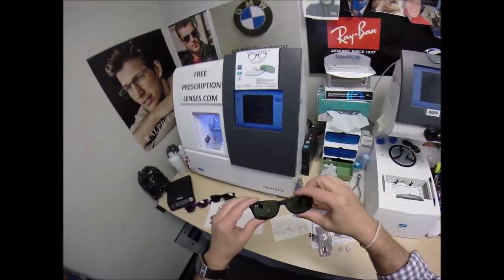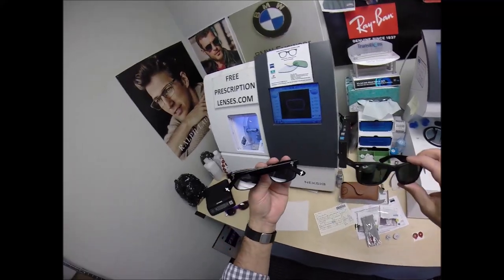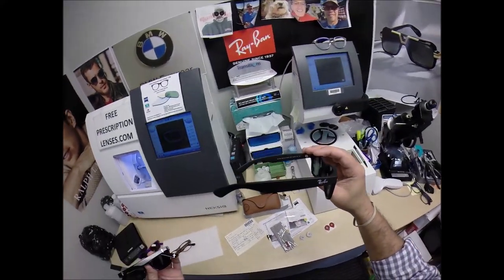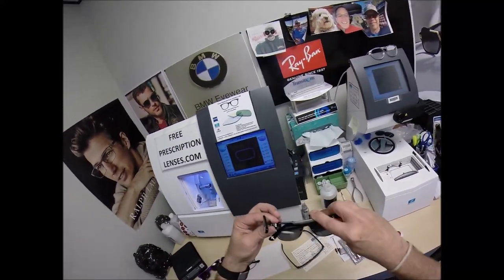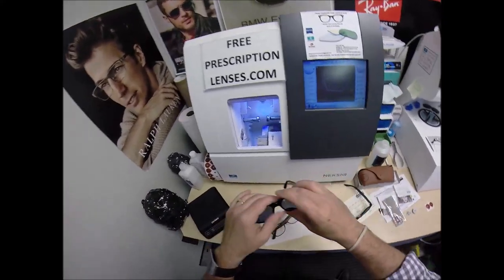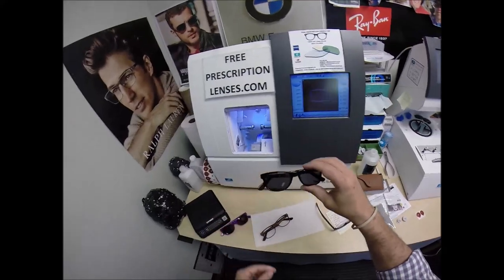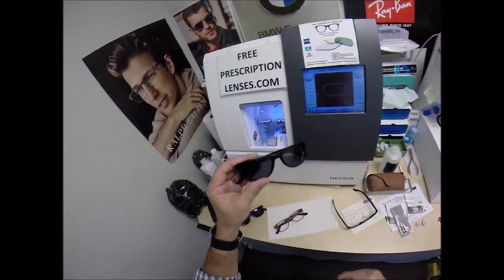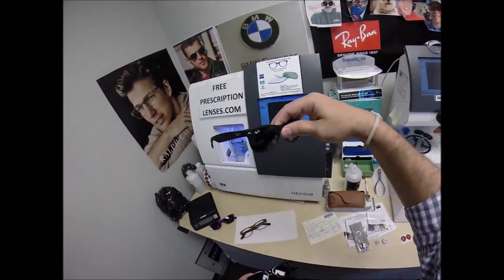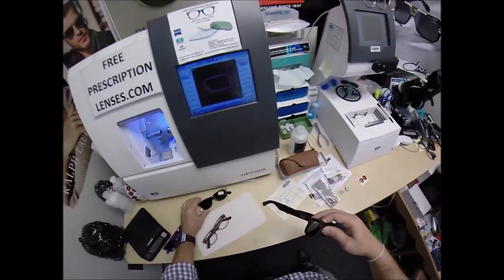They remind me of something else — could it be the new frames that I just designed, the Christian eyewear? This is Ray-Ban model number 2132. This frame is the John 316. People are telling me that I've worn this frame — it is identical to this frame. People who have worn this frame for many, many years are now wearing this one and cannot tell a difference.